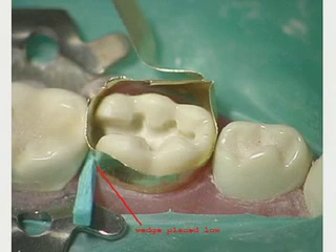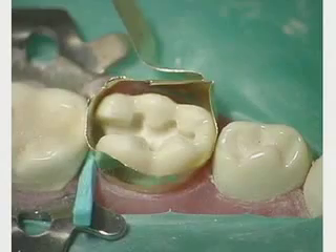Bend the wedge low from the widest embrasure, which is the lingual. The objective of the wedge is to close the gingival floor tightly to create a physical separation to make up for the width of the matrix band. Use the ball burnisher to burnish the matrix band to the approximating tooth.